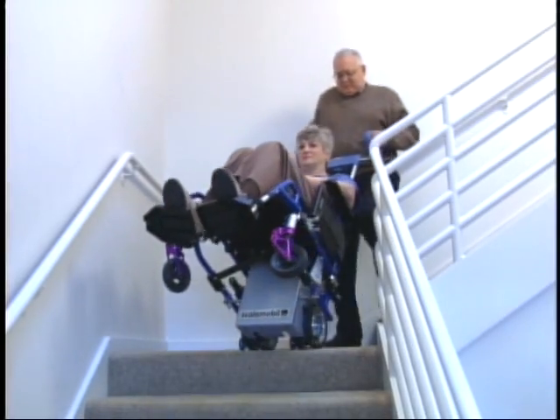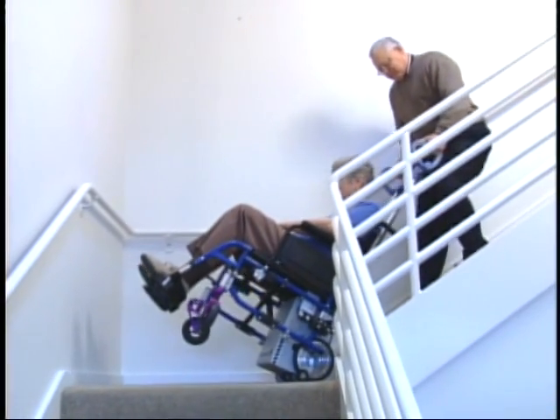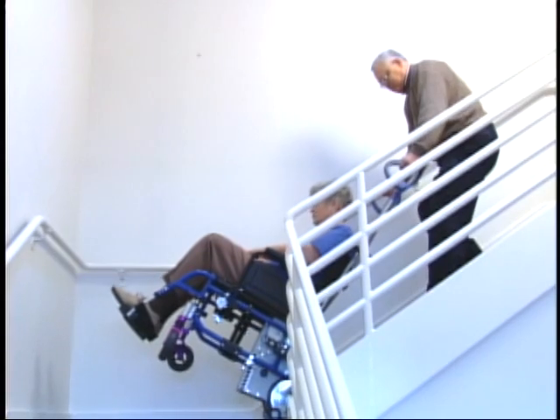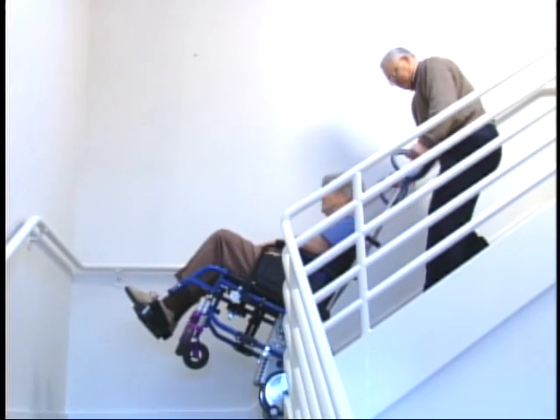Landings are no problem as the wheelchair swings around to continue on the next set of stairs. Even spiral staircases and different step surfaces are no match for the Scalamobil.